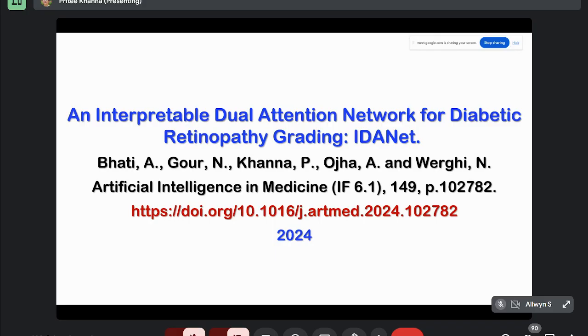As I told you, most of the existing methods were trained and tested on seen data only. But when we go for real time applications, the sample may have different illumination conditions and different optical factors, so the sample characteristics might be different from the training samples, right?